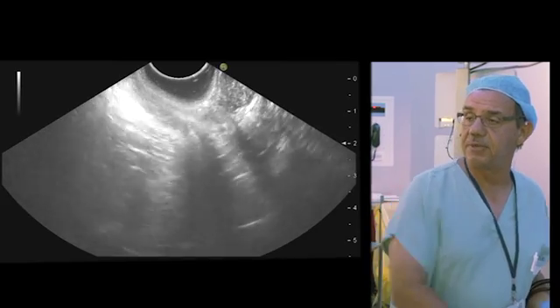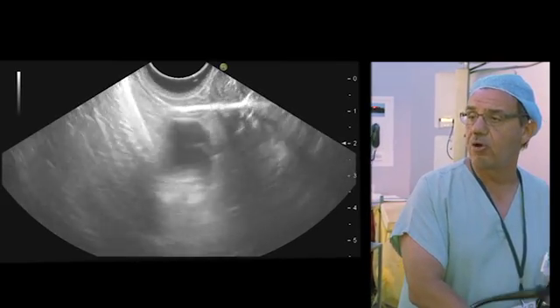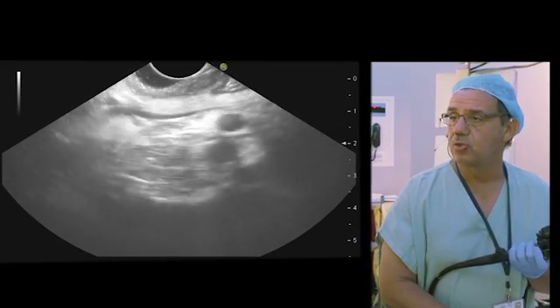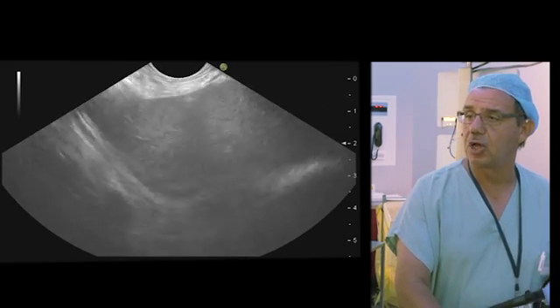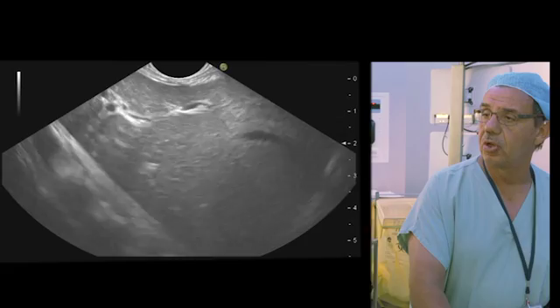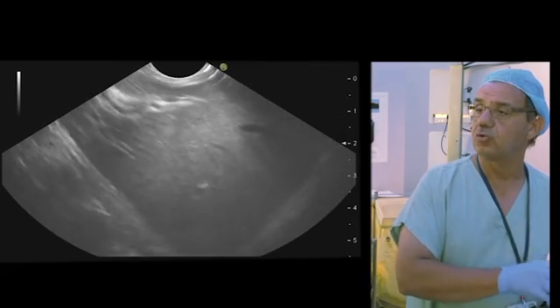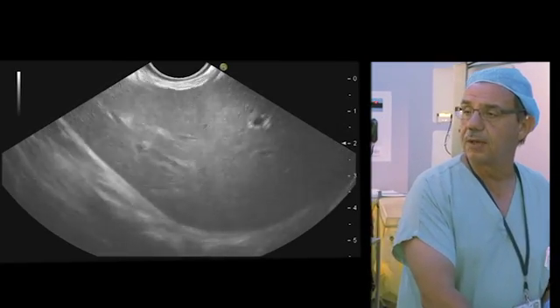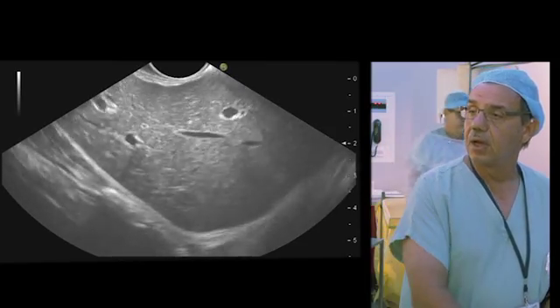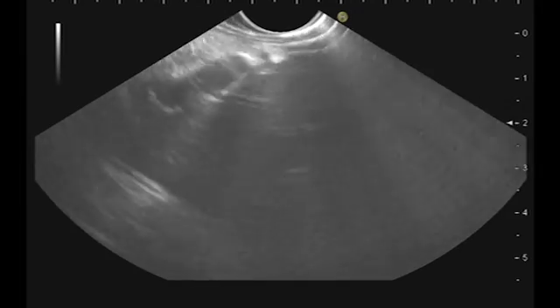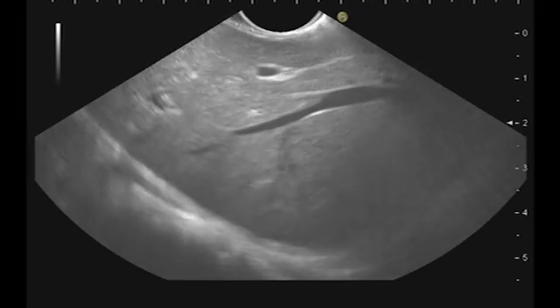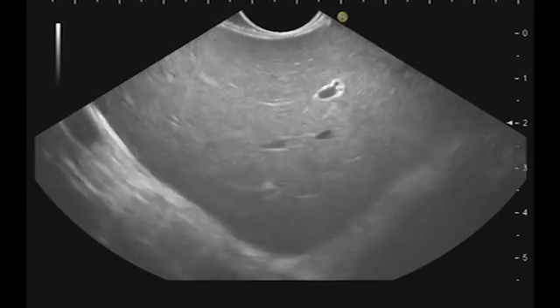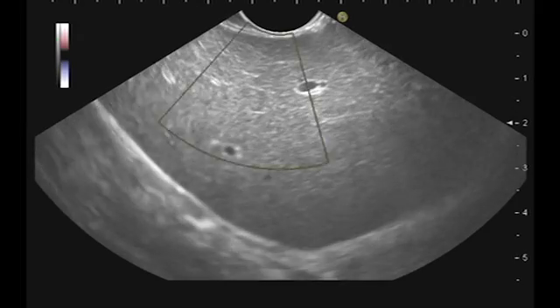Now I think this examination has shown a normal pancreas, a normal gallbladder, a normal CBD. I think the next step is to perform a liver biopsy. I will use the Procore needle, the 20 or 19 gauge, to obtain histology of the biopsy at the level of the left lobe, to exclude the diagnosis of primary sclerosing cholangitis. I will use the new Procore 20 gauge needle. I will perform the biopsy and after, the examination will be finished. I will select this area because in this area there are no vessels.